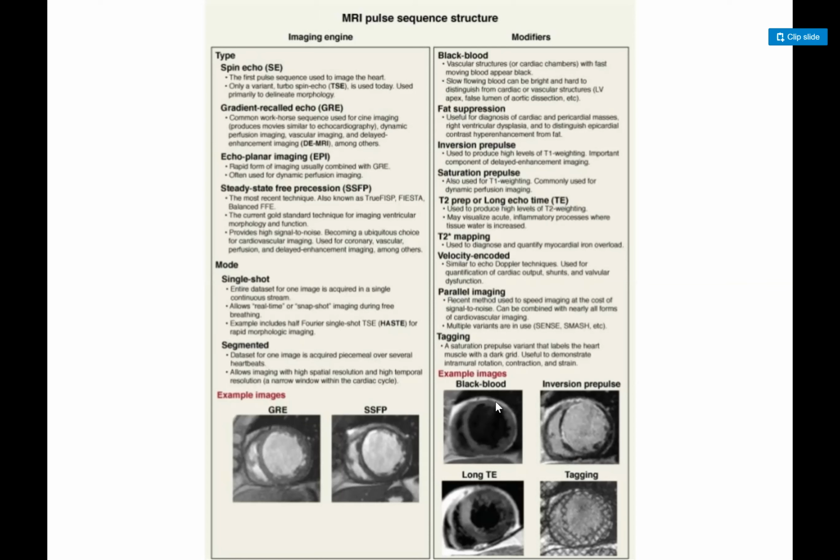Parallel imaging, we do not have that available, but what that means is that at the same time, we are getting many MRIs done at the same time. So you can do imaging by a factor of 4, which means you're getting information 4 times per beat. We are getting a coil. I'm hearing that we've been getting this coil since last year, but hopefully we'll get it, which will help us to do it. Right now we can do by a factor of 2 only.